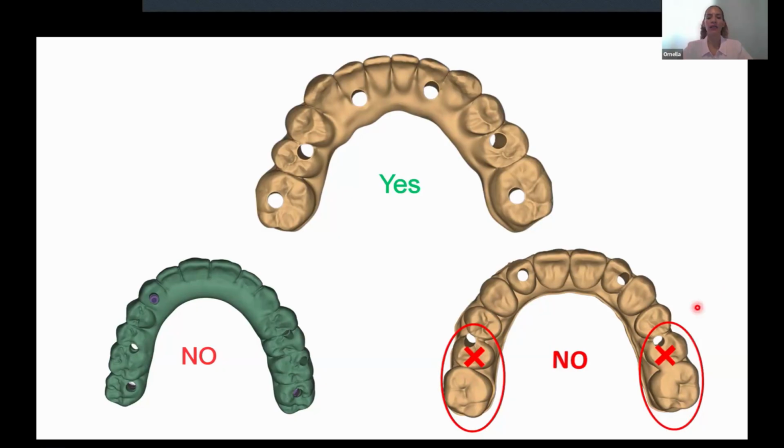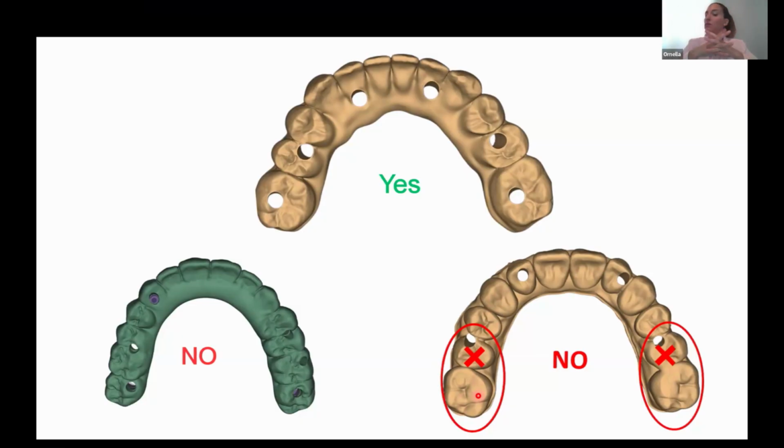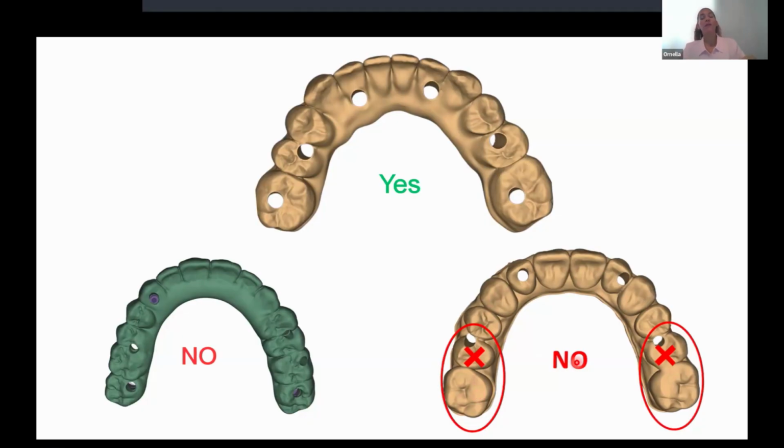So imagine that our doctor said, okay, but I want this aesthetic. I want two pieces in cantilever because our patient has a big smile and we can see the full arch, all the teeth, okay, in the mouth. So I don't want to reduce the size, okay? It's okay, no problem. We can do this type of design, but remember again, we need to reinforce first with an E-bar and then the upper with the graphene restoration, okay?